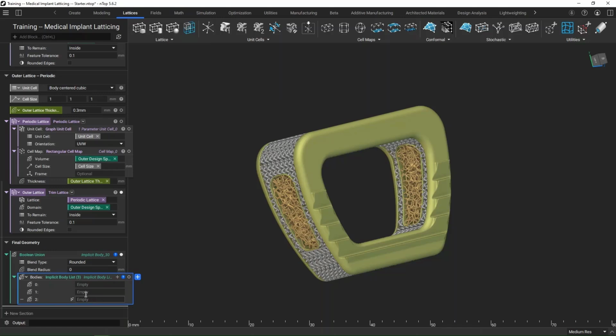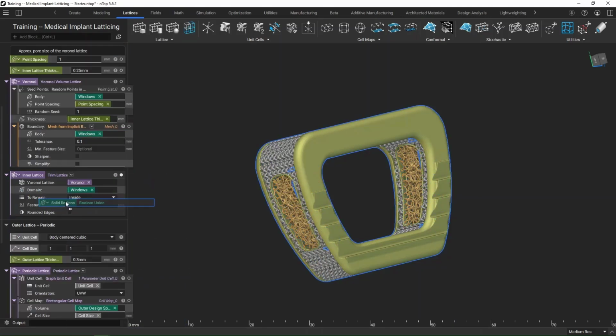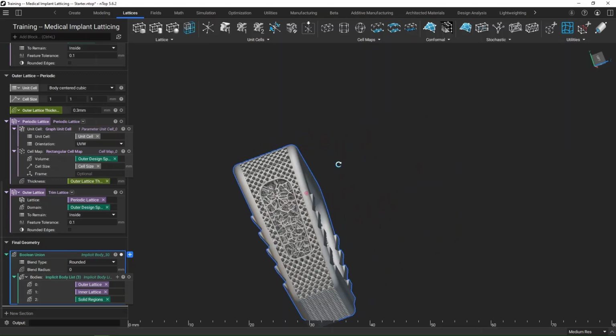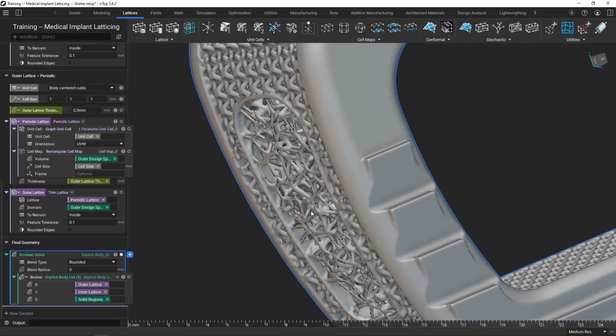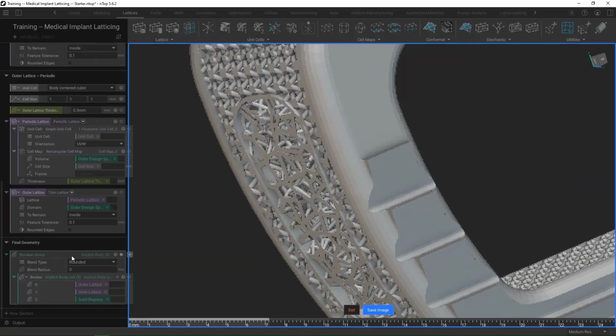I'm just going to use 3 for now. So I can drag my outer lattice. I can drag my inner lattice. And lastly, I can drag that solid region down to here. And so as we see, now we're just looking at a single geometry from there, all the same color again. If I wanted to look at that in detail, I'm just working in medium resolution right now. I can click on this, hit Control H for a nice high res render. It'll just take a second to load there. But we can see kind of how everything's adapting, how everything's connecting.